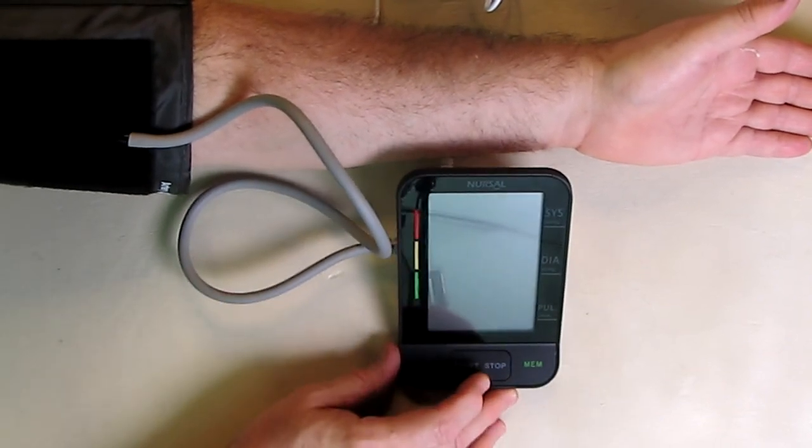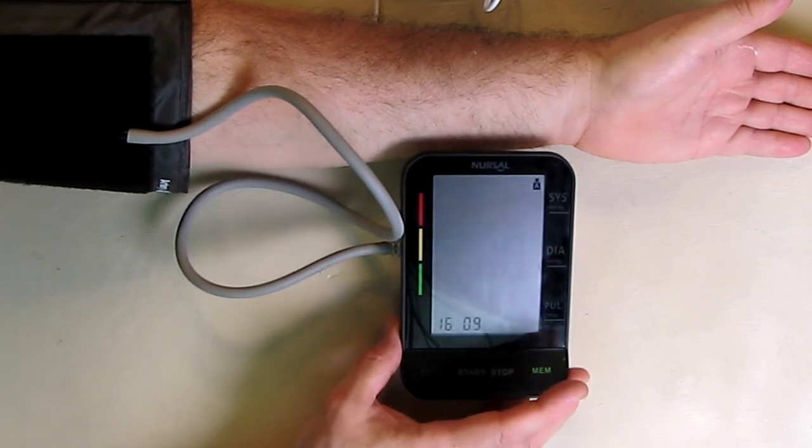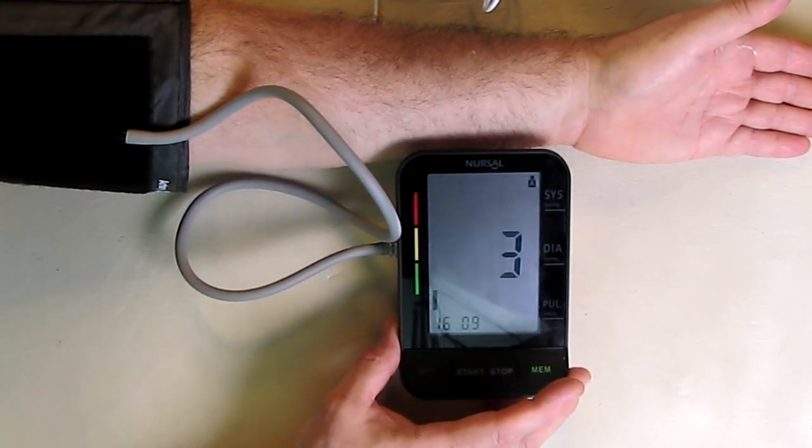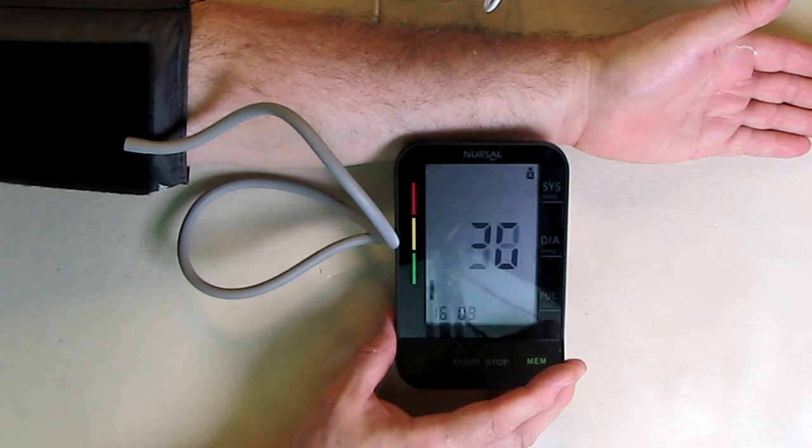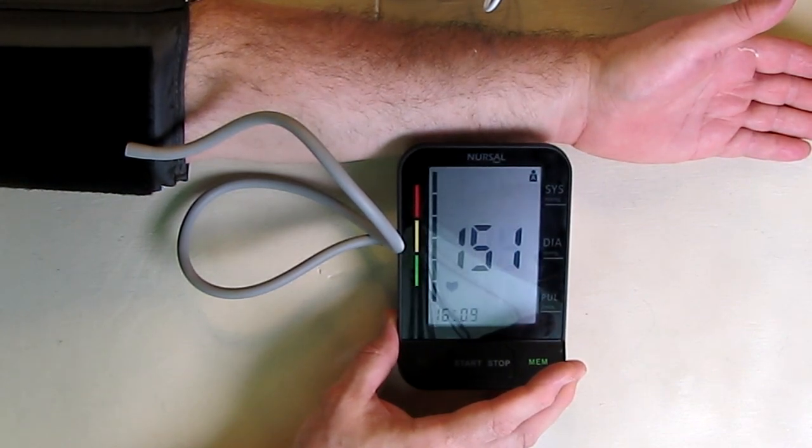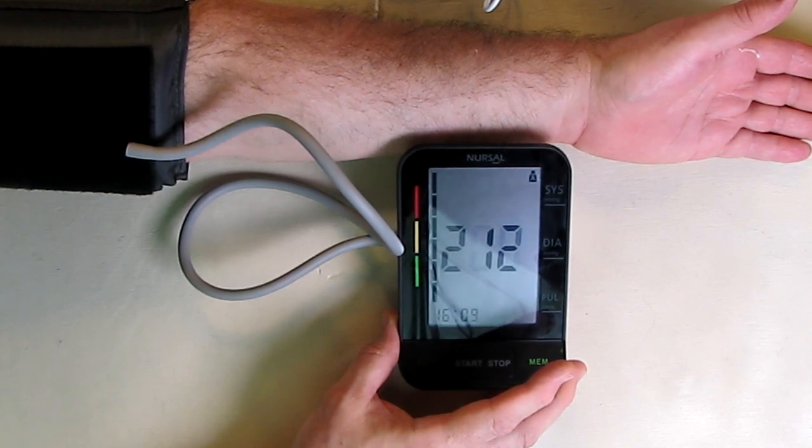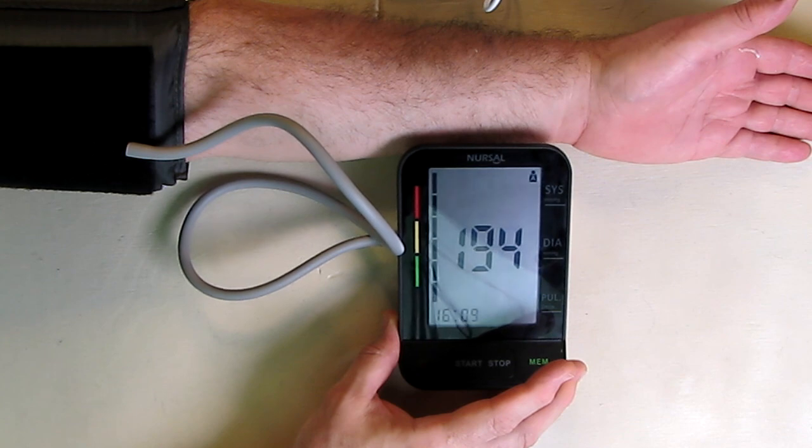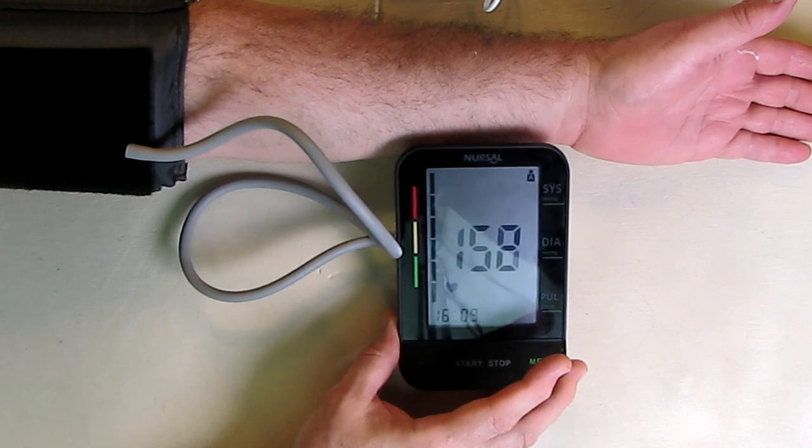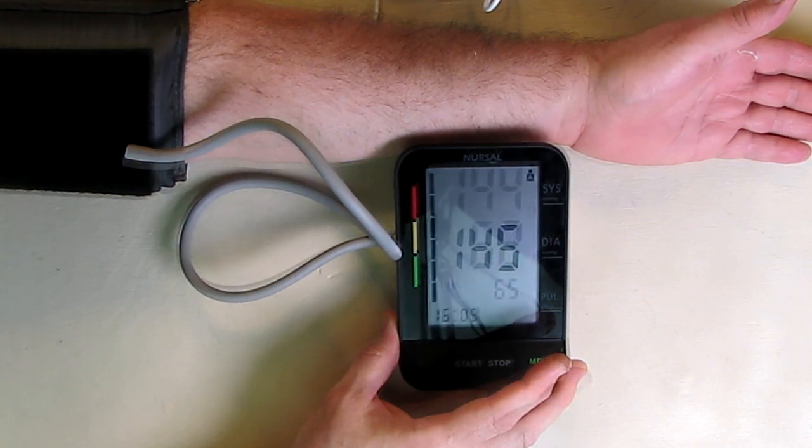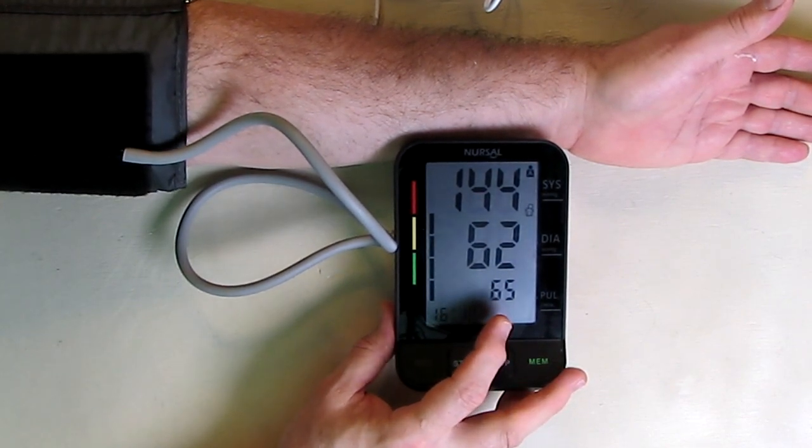Now, let's try to get a blood pressure measurement. Hit the start button. You can hear it inflating. It's on user A. Now it's showing you the pressure. Now it's readjusting. See the little heart symbol over there? That's actually your pulse. And there you go. It's 144 over 62, and my pulse is 65.